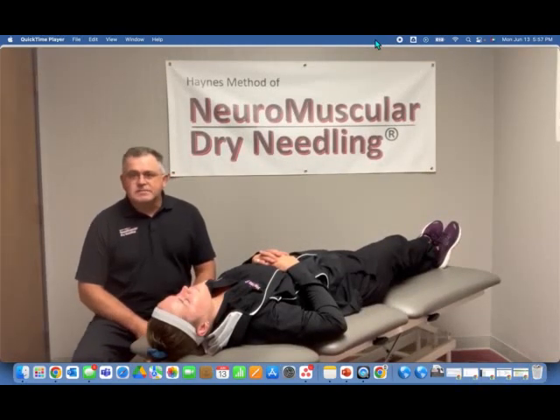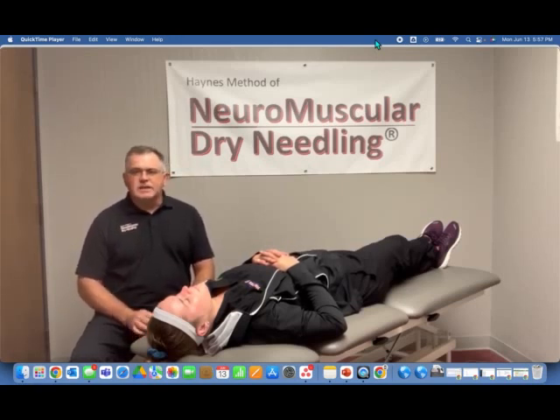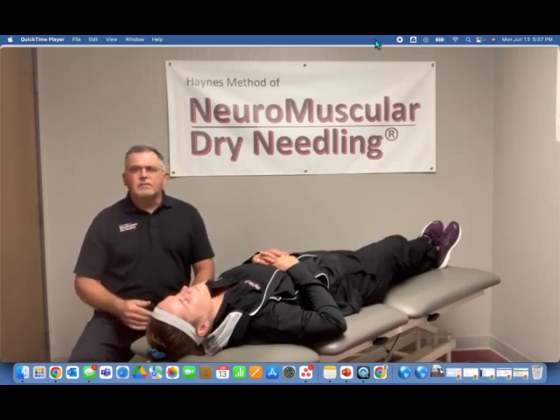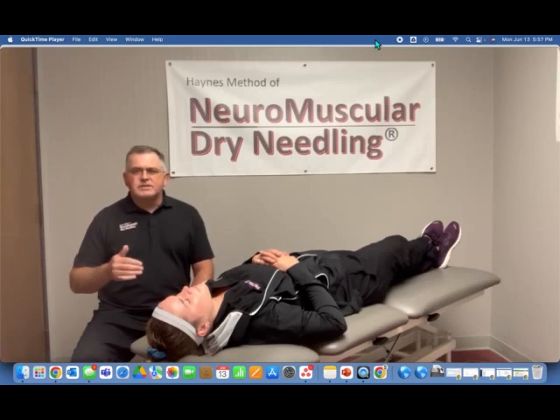For zygomaticus major, position here, the patient can be supine or sideline. The needle length is going to be 1.5 centimeters, and the backdrop there is none. We'll palpate the inferior border of the zygomatic bone, and we're going to note where the bone moves superiorly at the level of the lateral border of the eye. 1 finger breadth caudal to the inferior zygomatic angle will place your needle, and we're going to advance it from anterior to posterior, and the muscle is superficial.